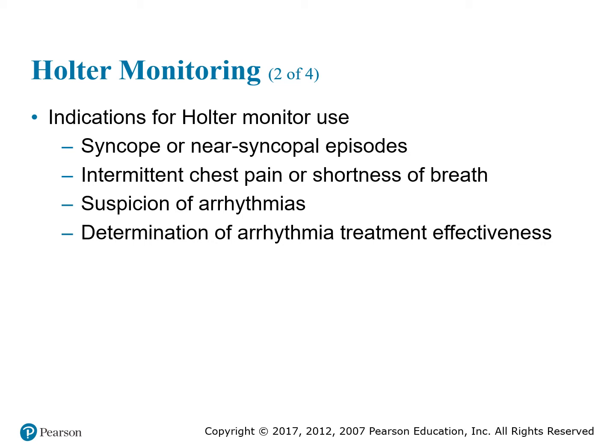Determination of arrhythmia treatment effectiveness. If the doctor has diagnosed the patient with arrhythmia, this is to make sure that treatment is being effective. So they will put the patient on a Holter monitor to reveal if the rhythm they're experiencing is being treated and if it's still occurring as often or not at all. They will also put a patient on a Holter monitor if they have had an implanted pacemaker to make sure that it's functioning correctly.